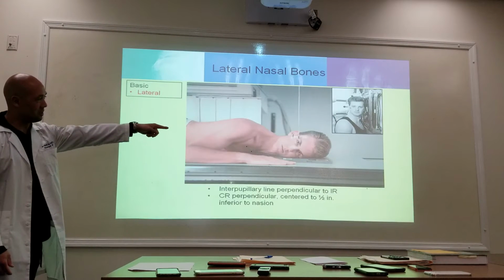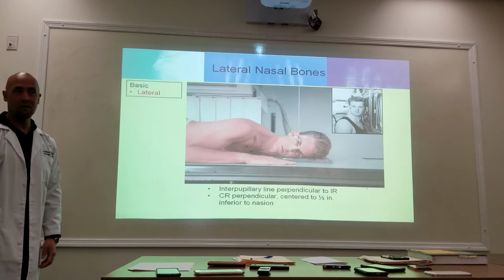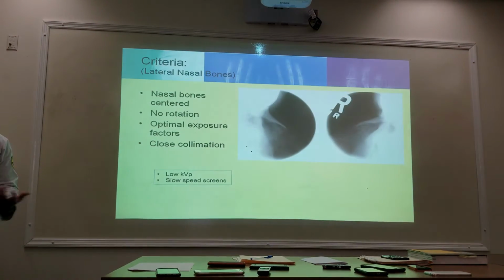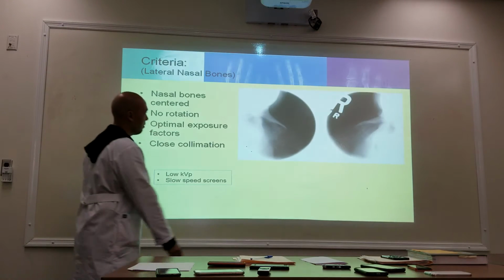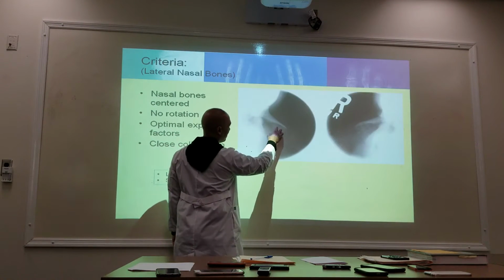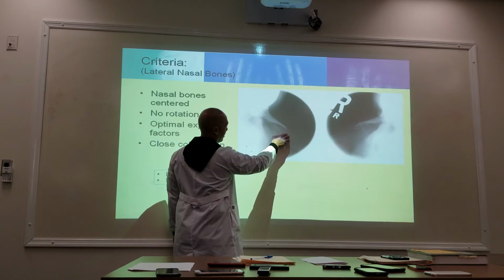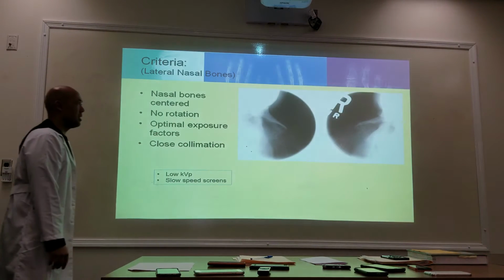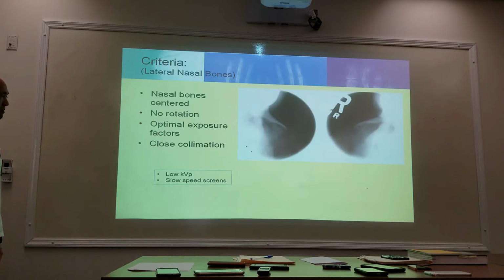And look how close the nasal bone is to the eyes. Okay? So collimate, be nice to your patient. This is all you need. Nasal bone, very thin. All this here, this is just cartilage. Okay? So we do it bilaterally. One left lateral, one right lateral.